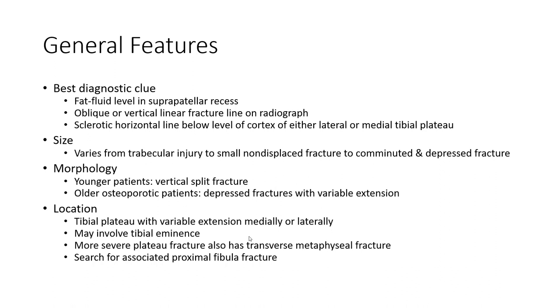By morphology, younger patients have a vertical split fracture, while older osteoporotic patients have a depressed fracture with variable extension. Location: tibial plateau with variable extension, medially or laterally, and may involve the tibial eminence. More severe plateau fractures also have a transverse metaphyseal fracture. Search for an associated proximal fibula fracture.